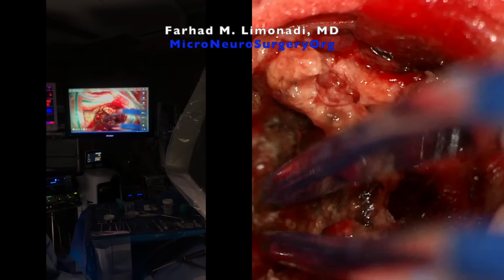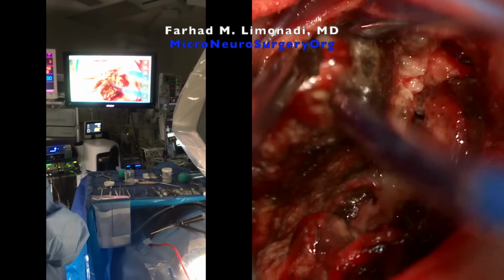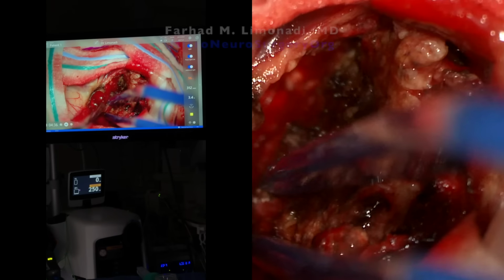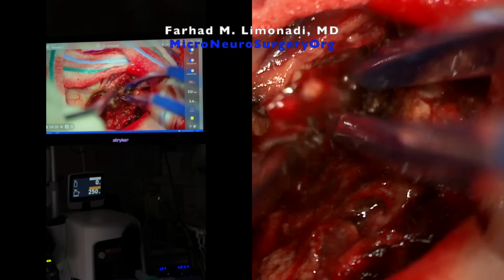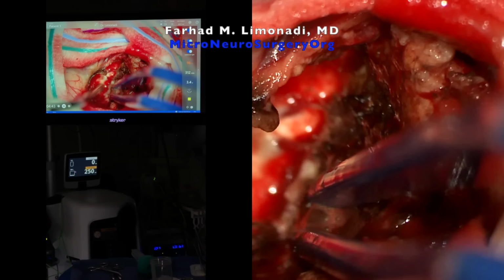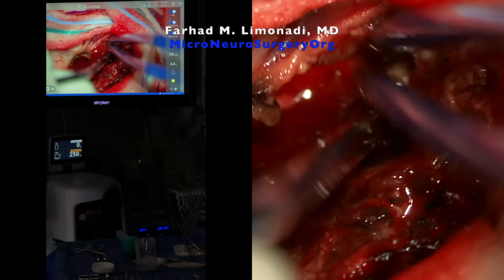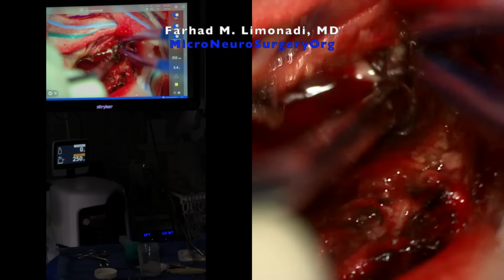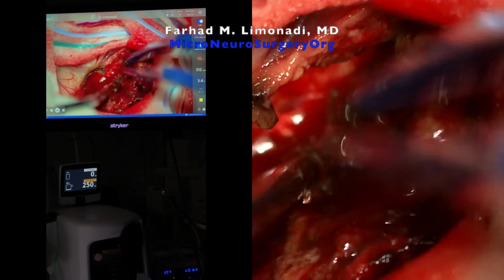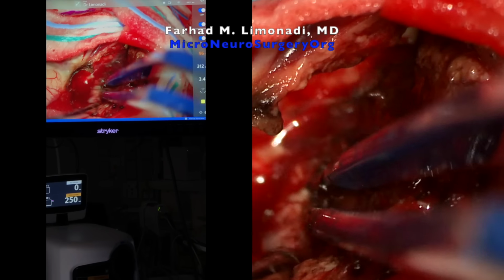By bipolarizing the capsule of the tumor, we make it more distinct from the brain, staying away from transmitting heat to the brain itself, and also making sure that you're following the tumor all around its borders. The cavity of the tumor has already been removed, so the capsule folds into the cavity really nicely. You're staying exactly on the border between the tumor and normal brain, only transmitting heat to the tumor and carefully separating it from the brain without any brain injury.